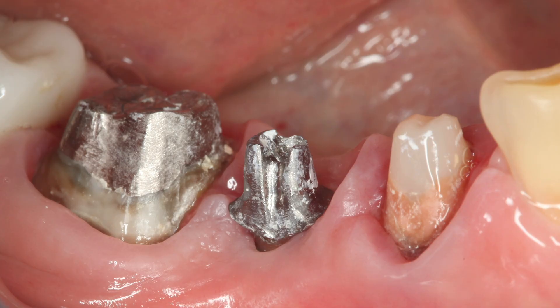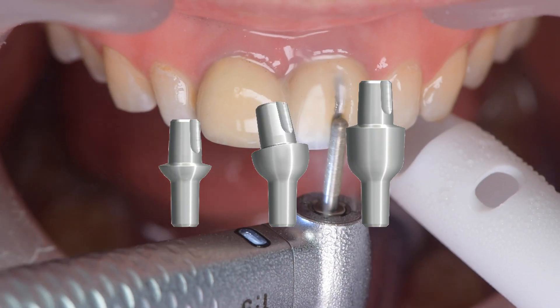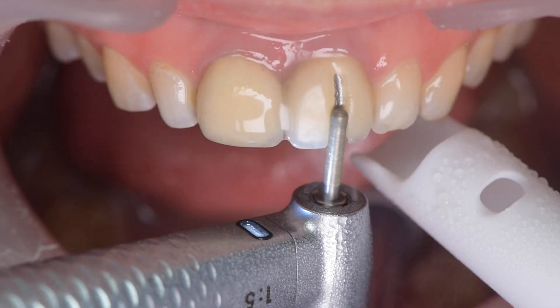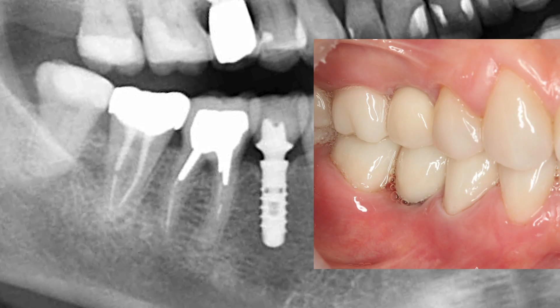If the abutment is held in the implant by friction force, the search for the screw will be a mistake. In this case, the crown can only be removed and the abutment can be used as a stump.